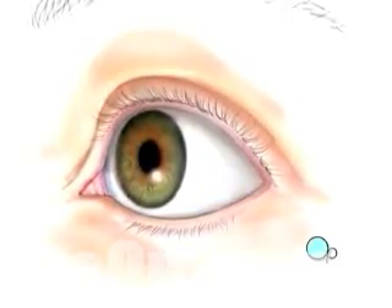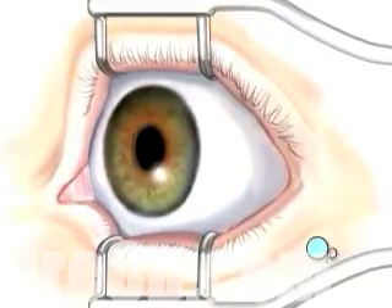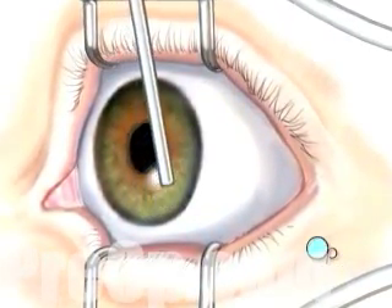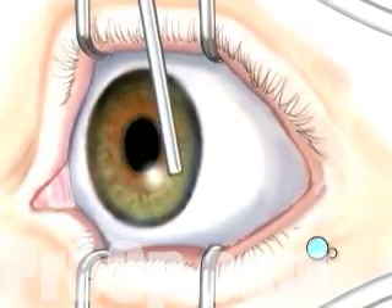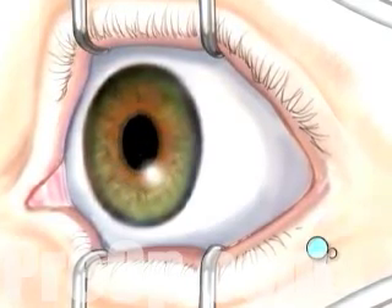An eyelid holder will be placed around the eye to prevent blinking. When the operative field is numb, the doctor will carefully remove the epithelium, or top layer of cells, exposing the stroma, the non-cellular portion of the cornea.